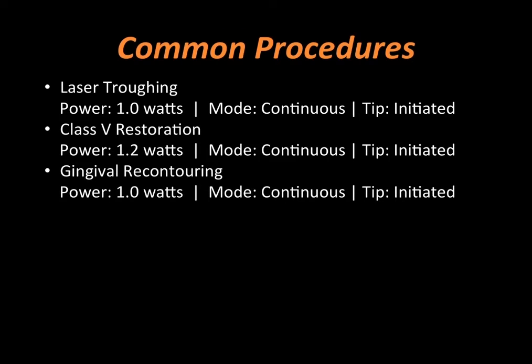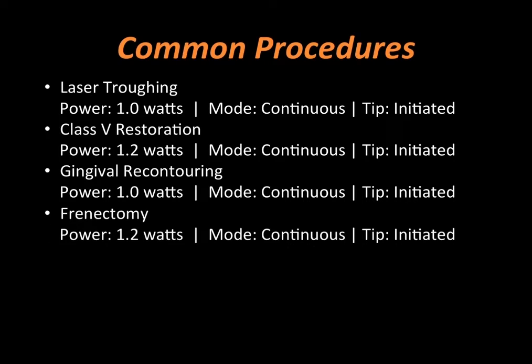Gingival recontouring in our aesthetic cases, those minor gingival contouring procedures are made very efficient using the diode laser. Our orthodontists, when they want us to do frenectomies, we can do these on young people with very little trauma, and it's kind of high tech, and the young people don't seem to mind it so much.